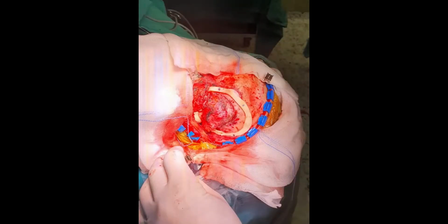The first picture shows the perfect fitting of the surgical guide on the frontal bone. The maxillofacial surgeon had a little bit harder job to do the osteotomy on the orbital part and the base of the skull. And the final result of the graft placement was a little bit sketchy on that side because they couldn't perform the perfect osteotomy on the base of the skull.